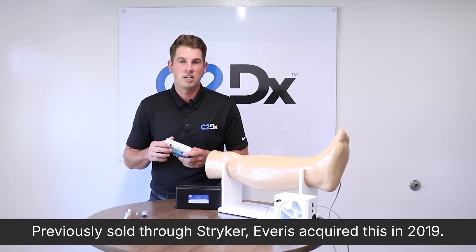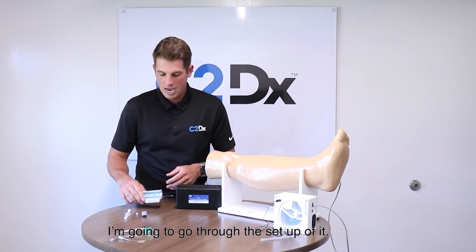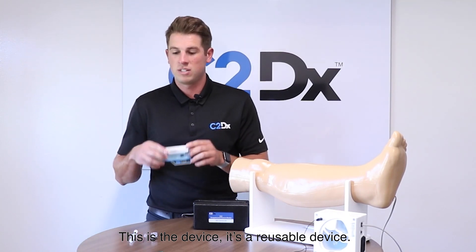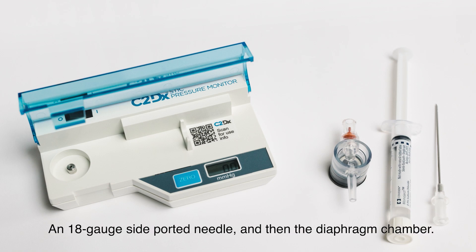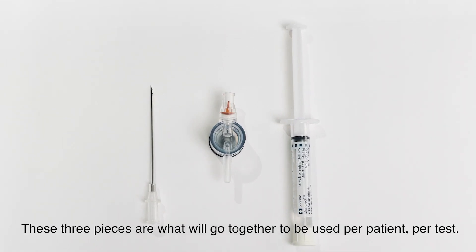Previously sold through Stryker, C2DX acquired this in 2019 — the Stryker pressure monitor for compartment syndrome. I'm going to go through the setup. This is the device; it is reusable. You also have disposable components: a pre-filled saline syringe, an 18-gauge side-ported needle, and a diaphragm chamber. These three pieces go together and are used per patient, per test.